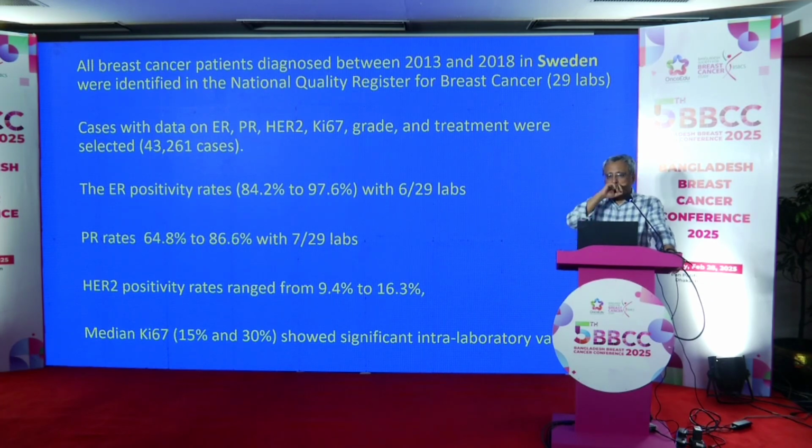And one of the reasons people look at these statistics is that this is essential for quality control. Like your lab, how is it performing? If you look at the past performance of the ER, say a 5-year trend, or PR, the last 5 years trend, then if your rate of positivity is going very high or very low, there's something wrong.